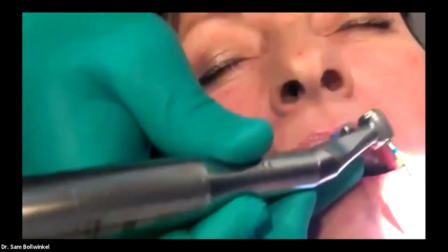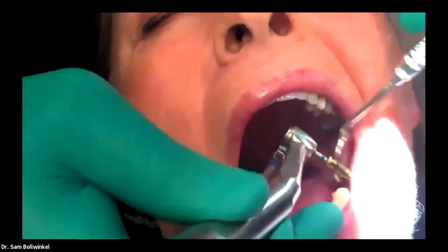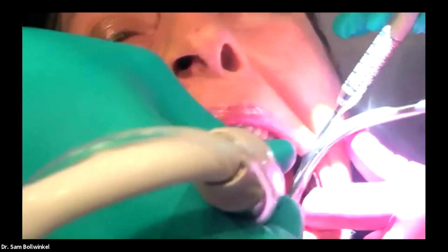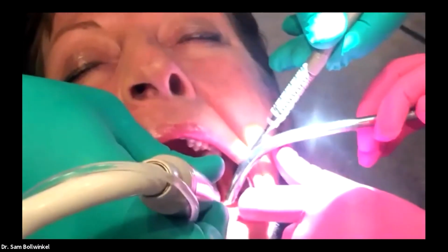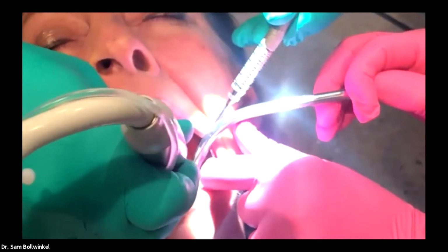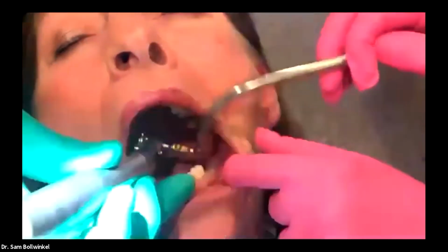So from here, we're going to create the conical shape. Section from right there. Good. Okay. Let's irrigate that one more time. Go ahead, I'll have you do that for me, Kim.